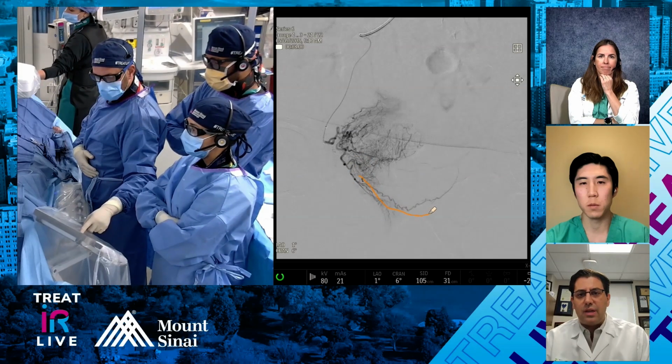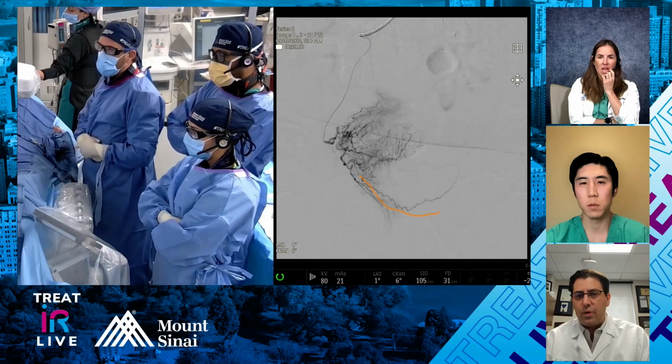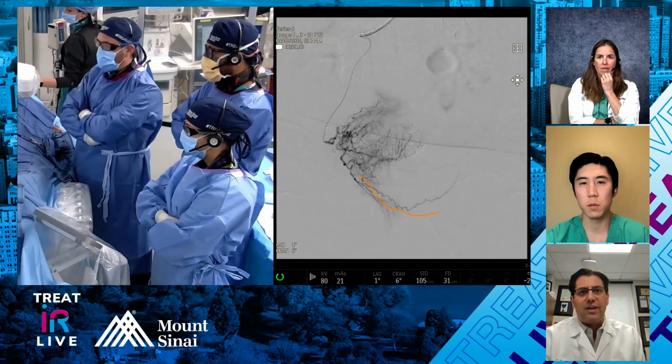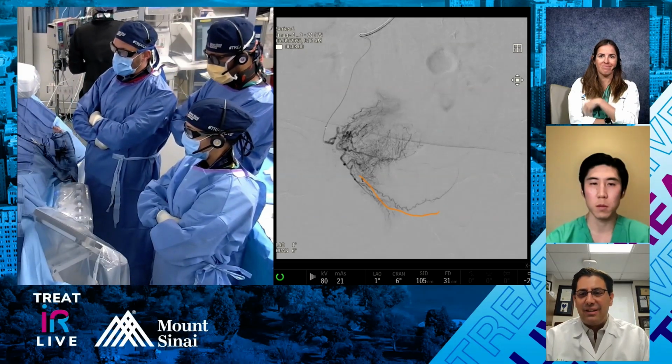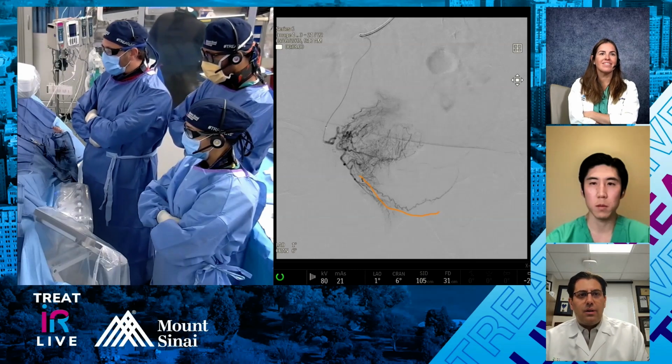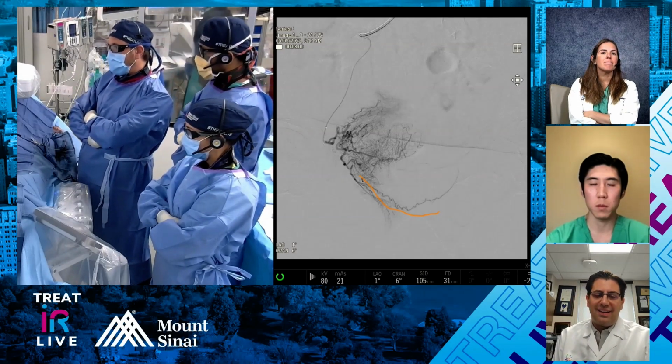And the only thing is that when you do the vasodilators, the original papers all said over 3 to 5 minutes. None of us are patient enough to put it in, but Dr. Fischman? Yeah, so looking at this angio, we see a couple different things.